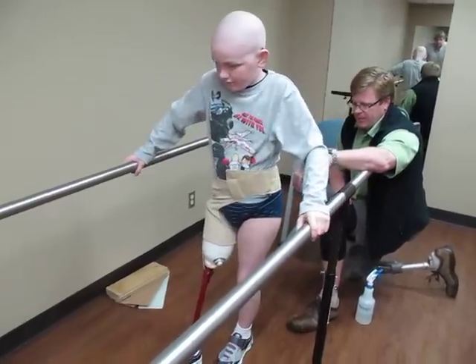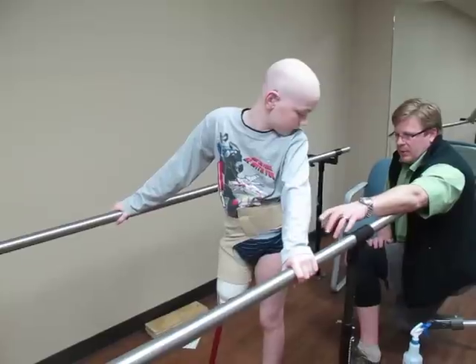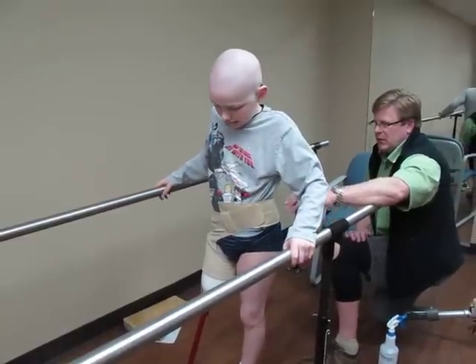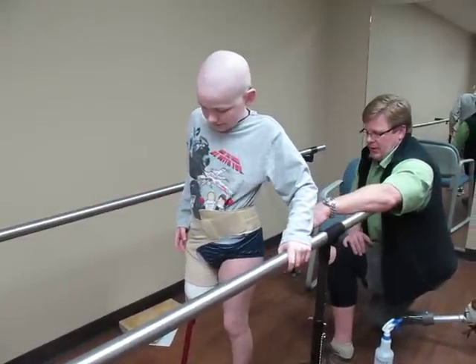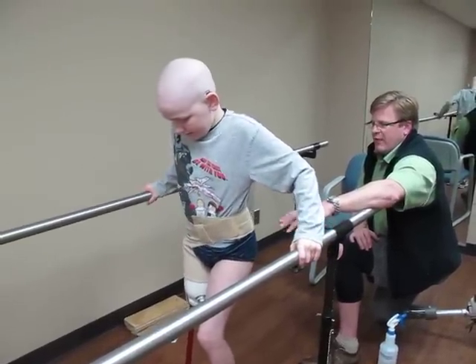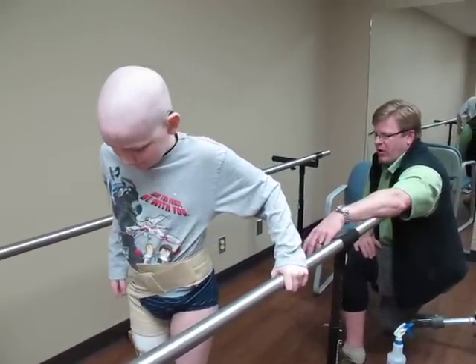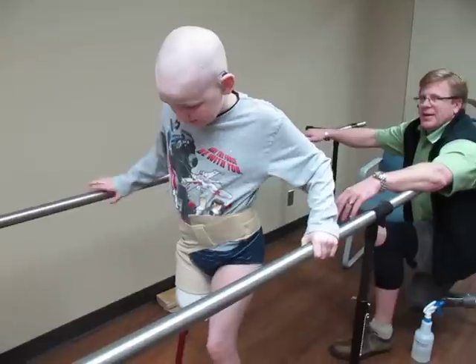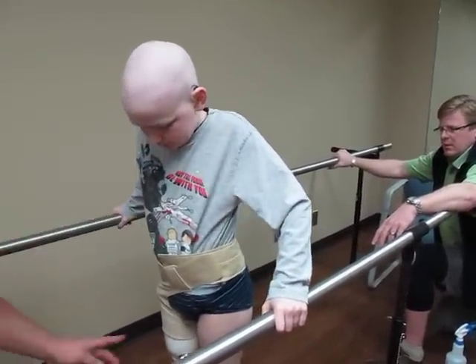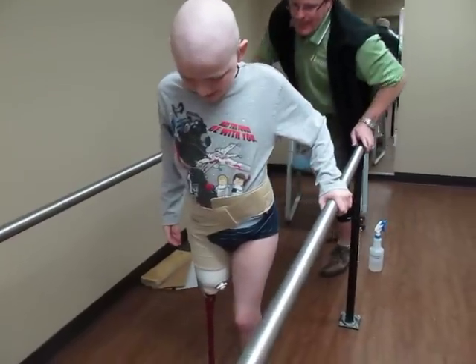Okay, now when you step — Trim. What? When you take a step, use this arm and take that arm off. Take this arm off. Take a step. You're going to have to balance over that leg a little bit. Fire those muscles in the prosthetics on that side where your leg's amputated. Fire those muscles. Hold it strong. I can't do that. Here's what you want to do — you can do it. Stop right there with your step. Keep it underneath. Now you can do it. Go ahead and step over. Just step on over. Sit in that bucket. Step over.